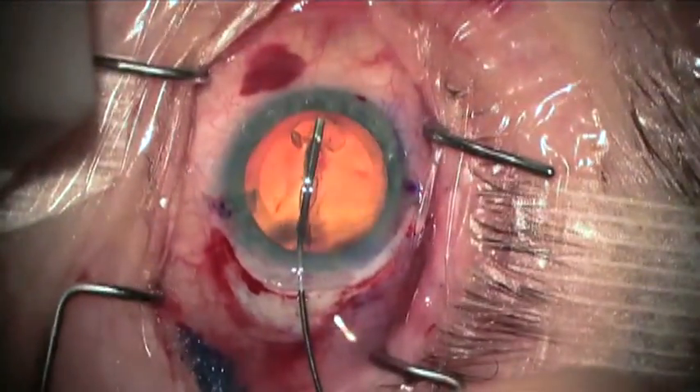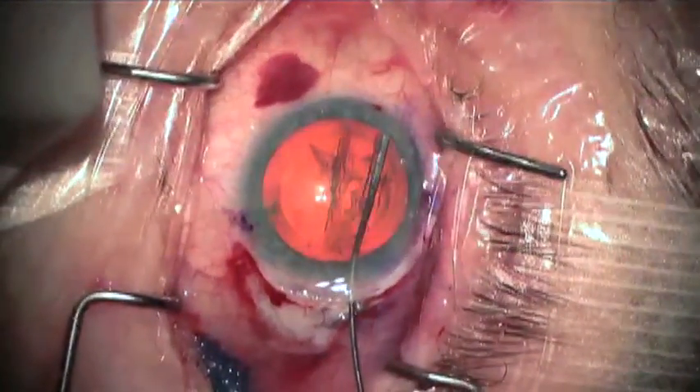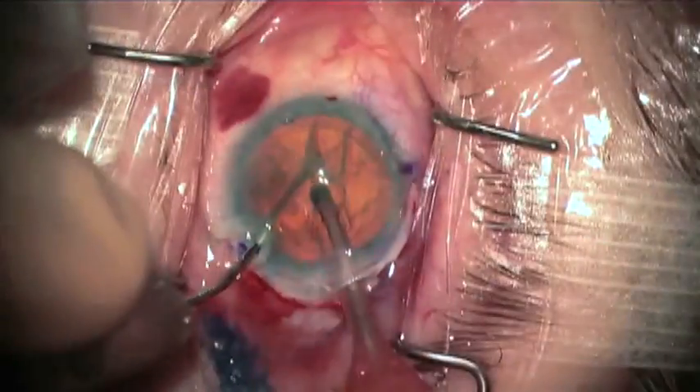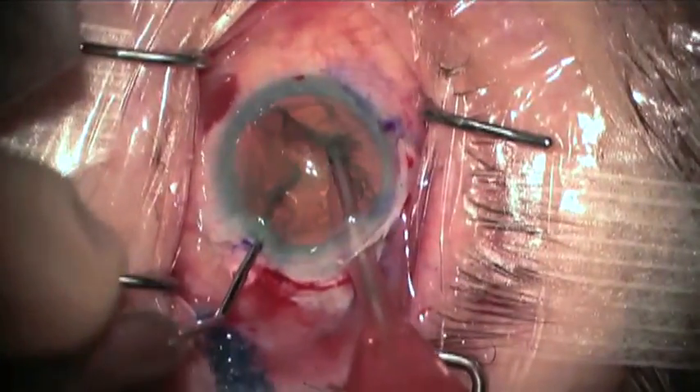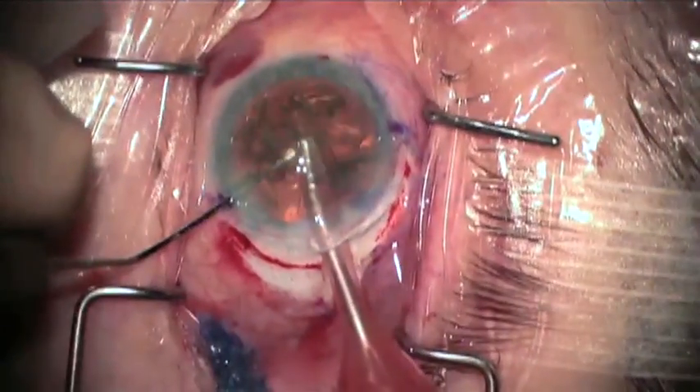And if the capsulorexis fails, the telescope cannot be implanted. Then as in routine cataract surgery, lens hydrodissection and nuclear chopped phacoemulsification is carried out.